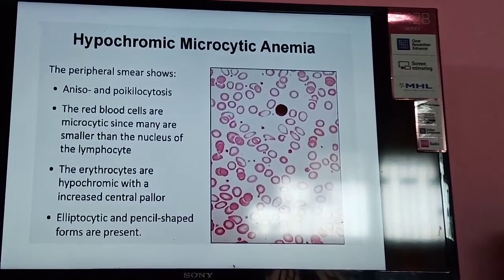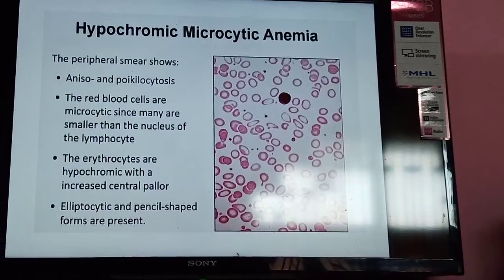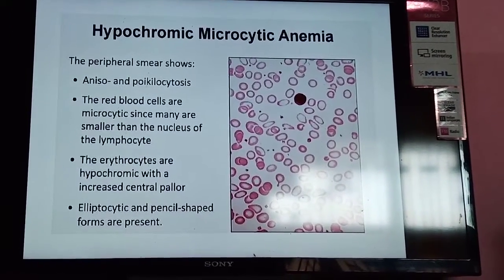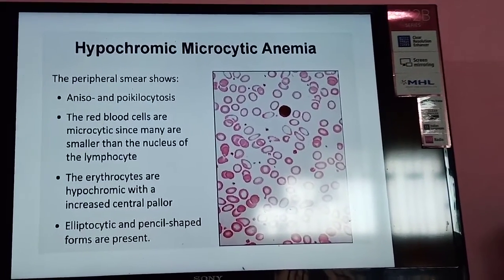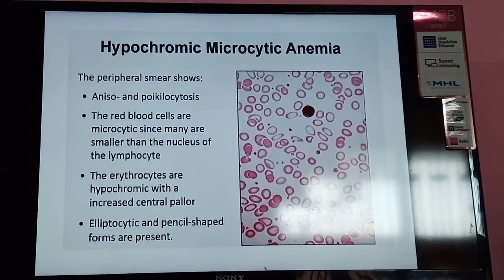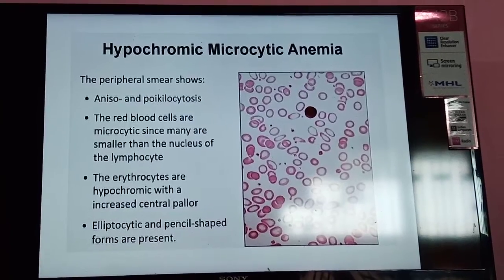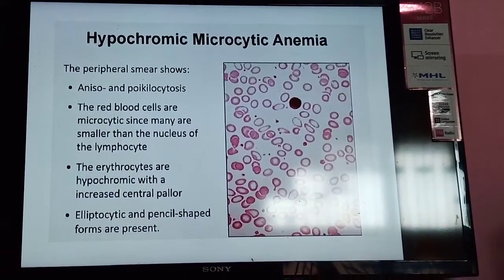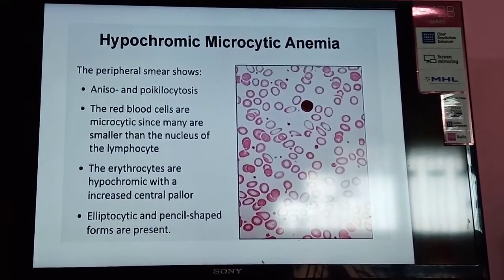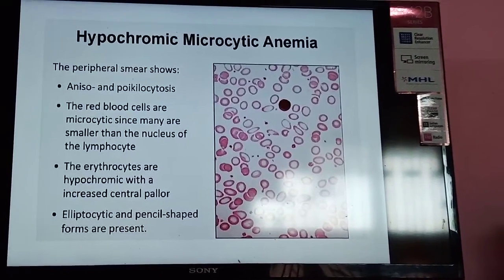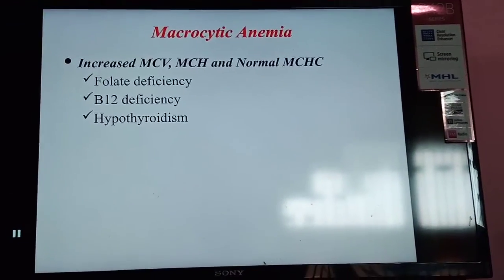In the peripheral smear diagram, the RBCs are microcytic — many are smaller than the nucleus of lymphocytes. The cells are hypochromic with increased central pallor. Elliptocytes and pencil cells or teardrop cells are also seen. Normally, the central pallor is one-third of the total RBC, but in this case it is increased, confirming hypochromic red cells.